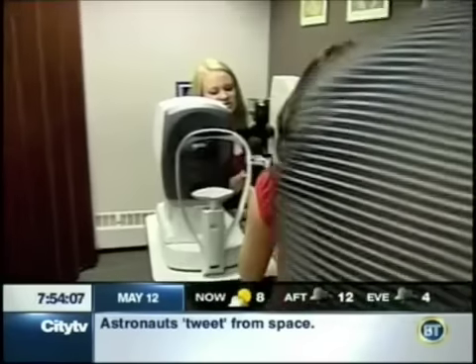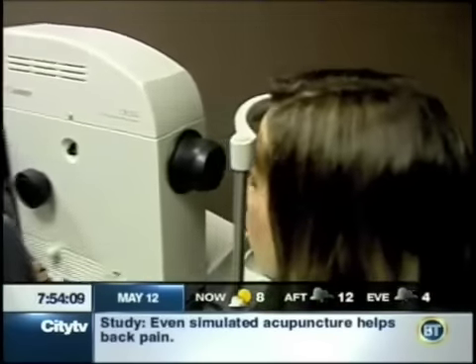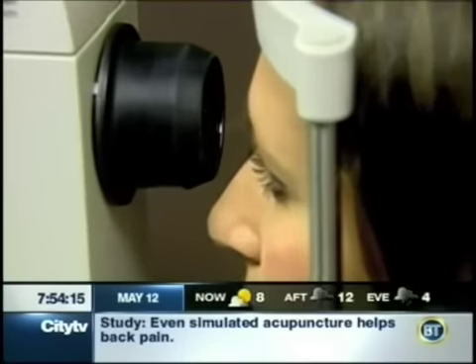Well, we're going to be taking some pictures of the back of your eye. Yeah, it's photo shoot time. Absolutely. And Wendy is the photographer, so I'll have a seat here. All right, Jill. So I need you to put your chin in the rest and your forehead up against the bar there again, please. Now, right in front of you, you're going to see an orange light. So I'll get you to look right at that for me. And there's a floating green light over here to your left. Now look at that, please. See it. Perfect. Now you're going to see a bright flash.